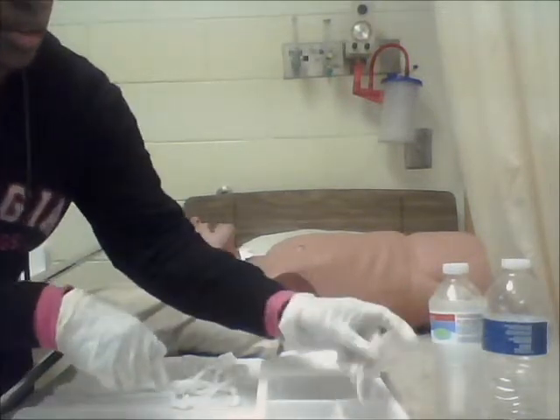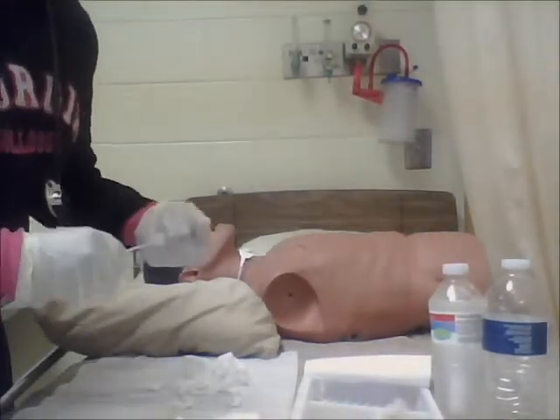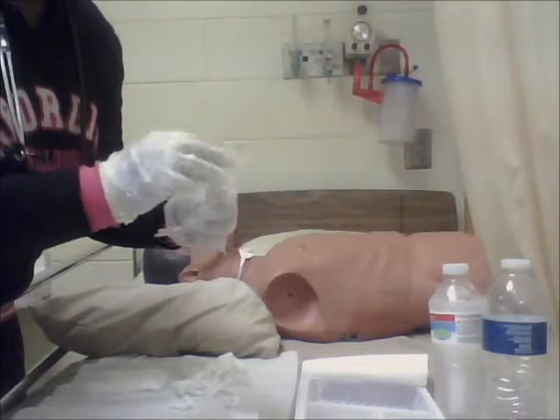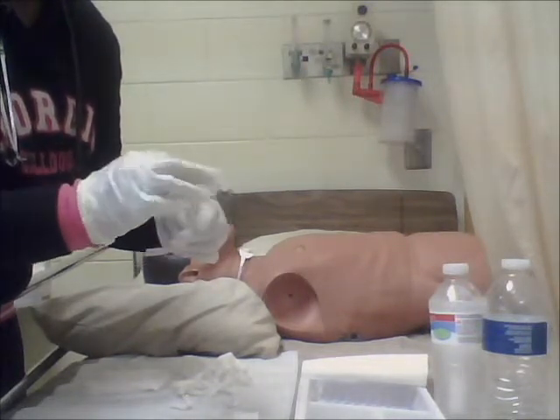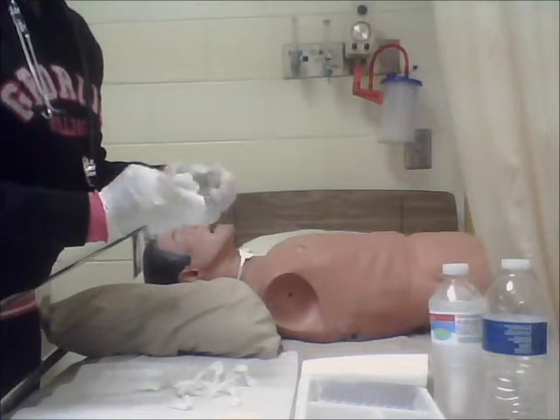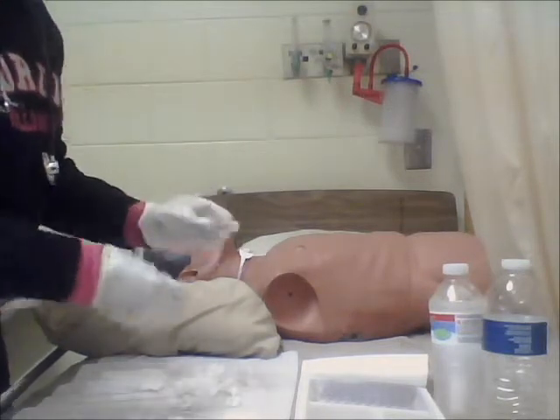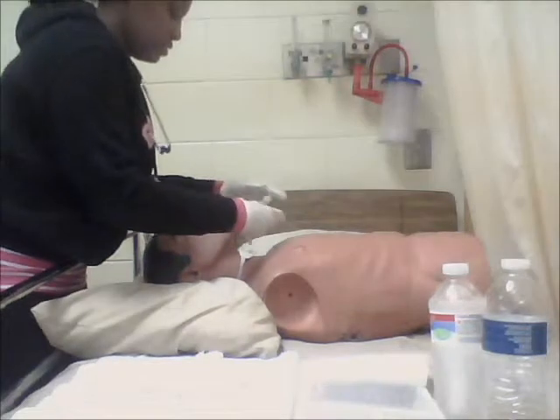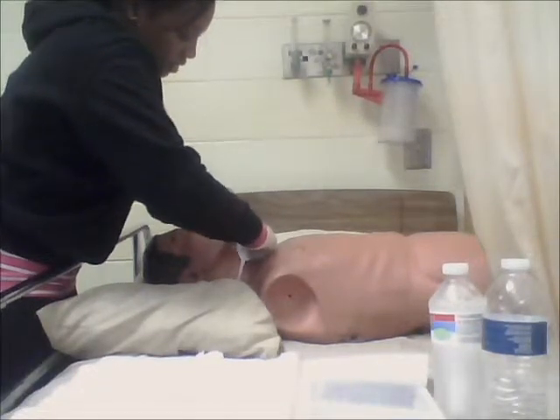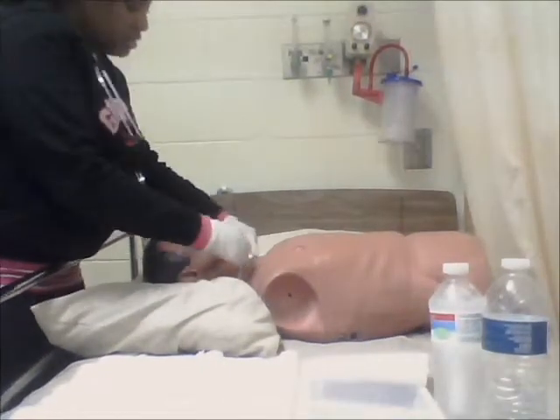And now I'm going to place the inner cannula into the sterile water. And I'm going to take the other pipe cleaner, go ahead and clean the inside, make sure I have everything out of the inner cannula. I'm going to dry the cannula off with the other gauze. Now I can insert the inner cannula, making sure I hear it click while holding, and it clicks so it's in place.